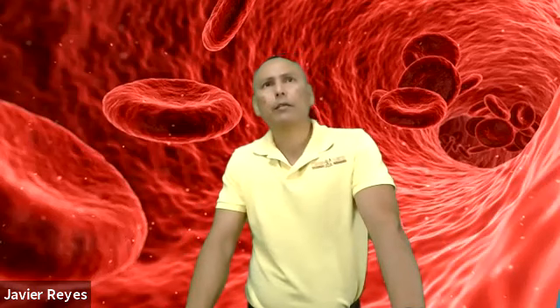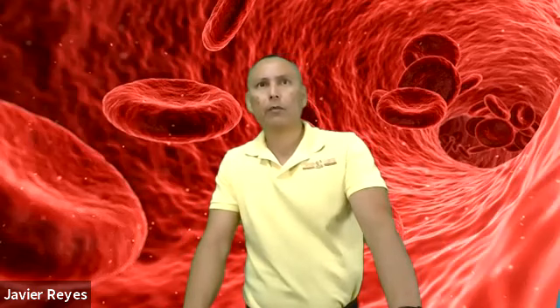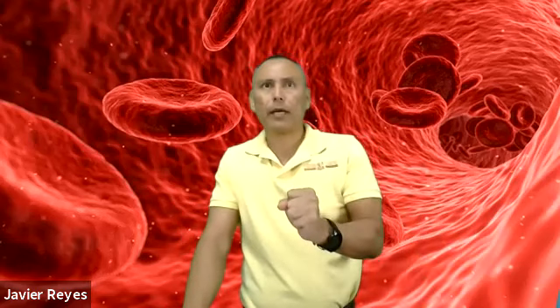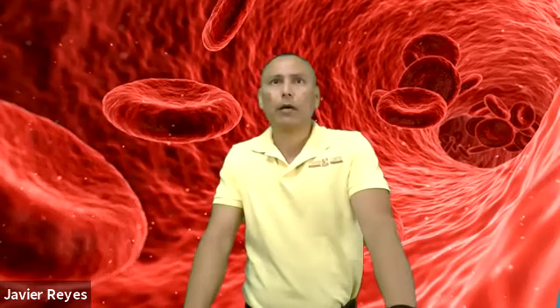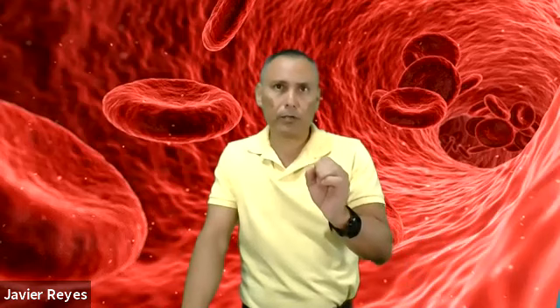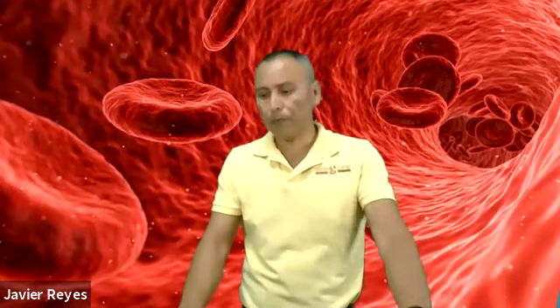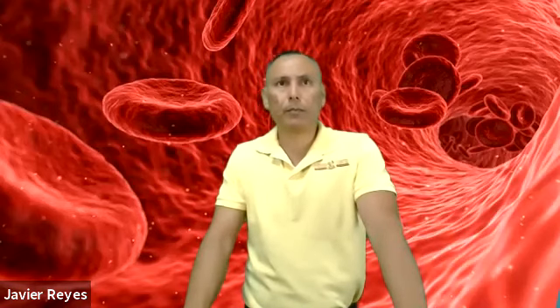So you try to troubleshoot failed vein punctures as much as you can when the vein walls draw together or they collapse, okay, caused by the vacuum or the plunger. If you use a very small syringe and you try to collect like that, the plunger will pull the vein and it will completely close, and therefore you will not be collecting any blood from that patient.